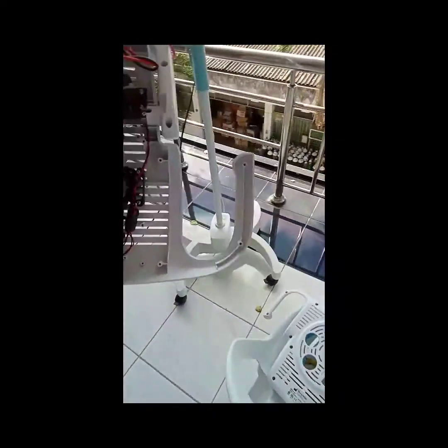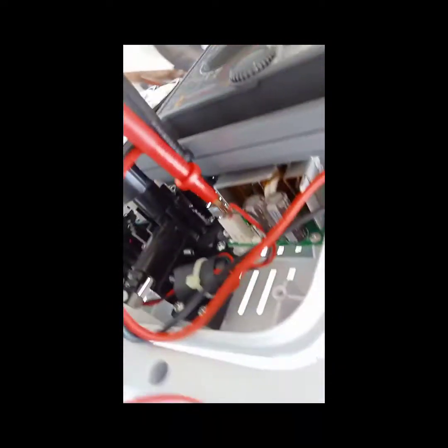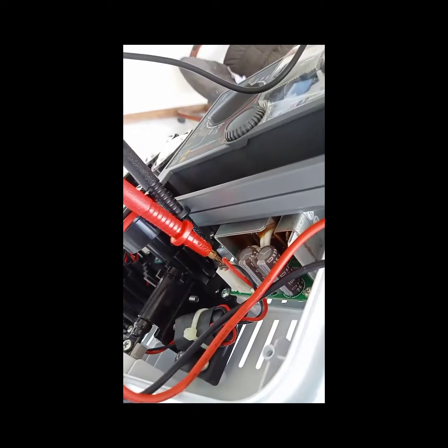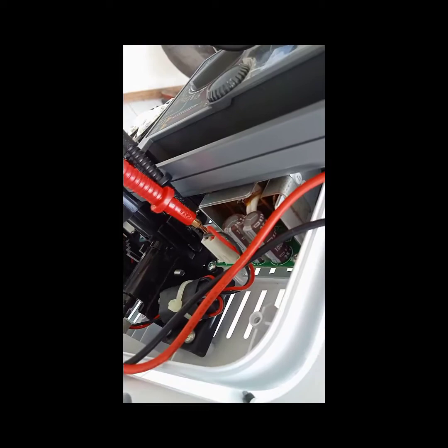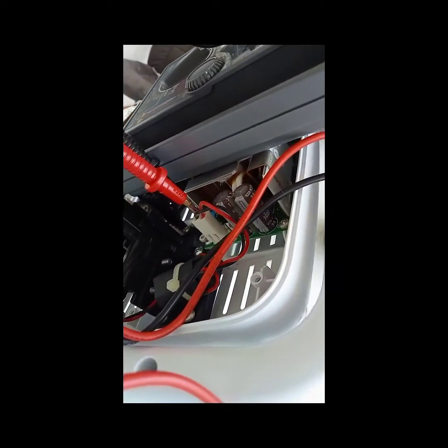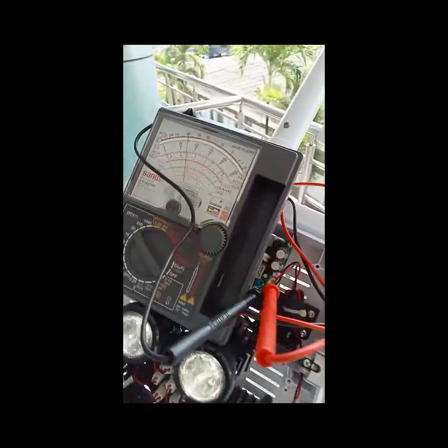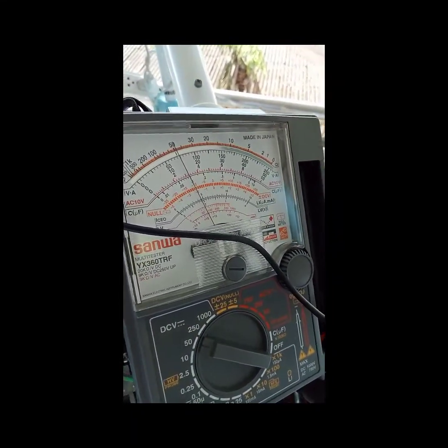And here we have the power supply right there. I already checked this one. As you can see there's the test point, and the voltage is steady at 15 volts.